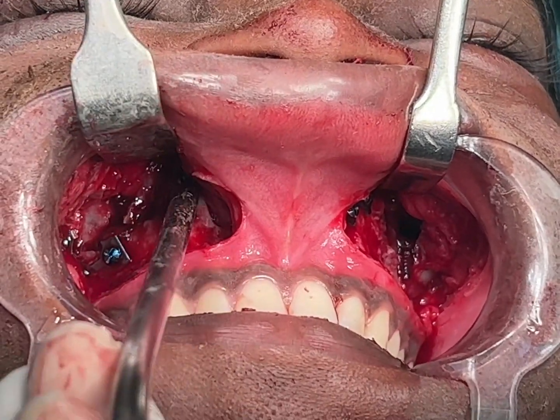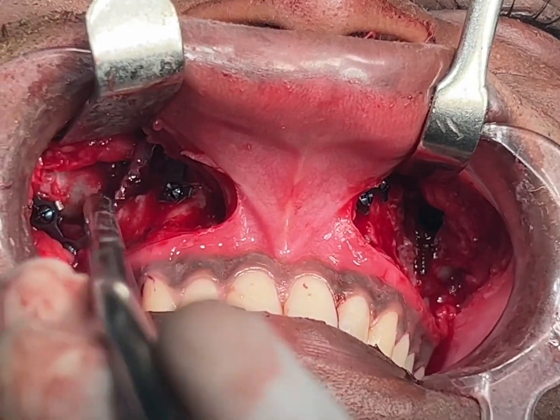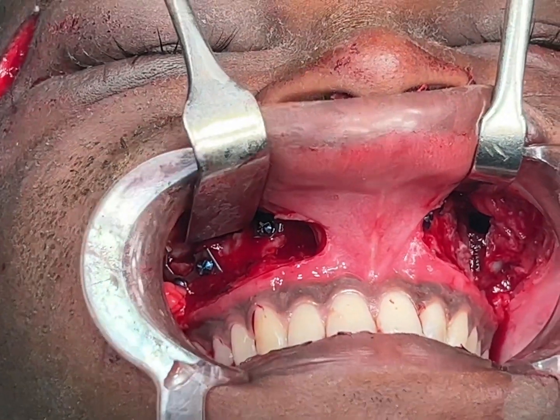There's a fracture here on the base — the pyriform rim, base of the nose — this one on the zygomatic buttress, one into the sinus, and one here on this pyriform rim as well.